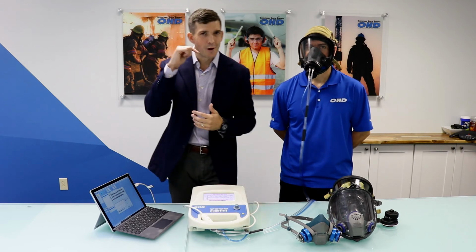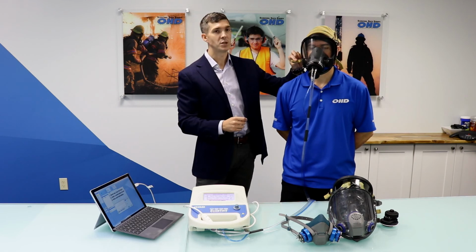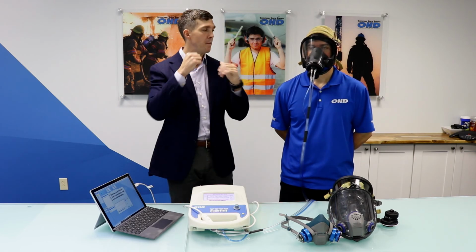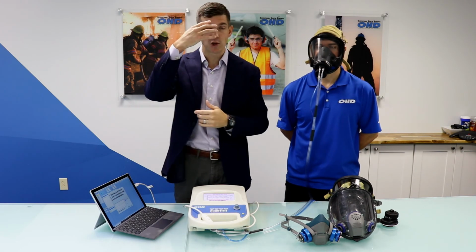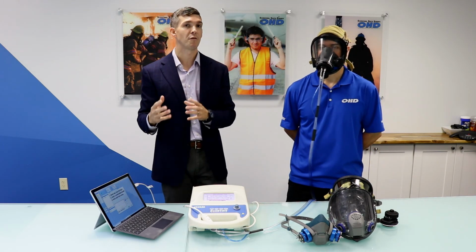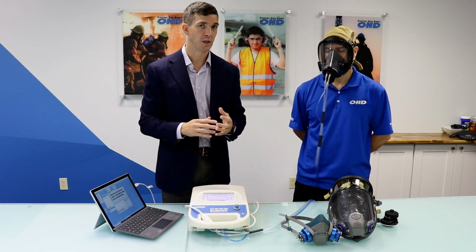You might think, well, why would someone ever put their finger in the seal? They wouldn't, or they shouldn't. But that simulates maybe a strap, that when you re-don the mask, did the strap get stuck back in the seal? Did you re-don it with facial hair that got stuck in that maybe wasn't there from the initial donning? So those are some things that we can now talk about from a troubleshooting standpoint.